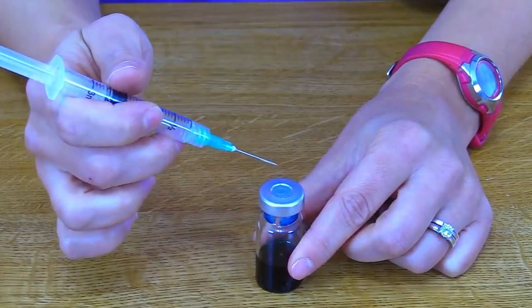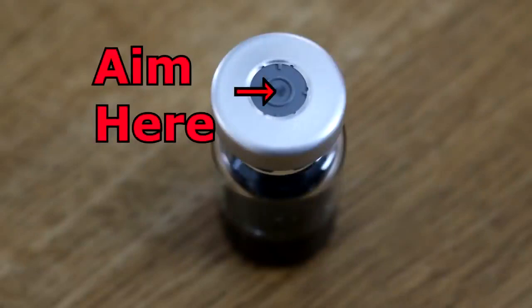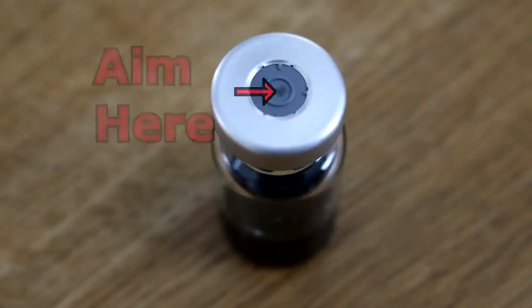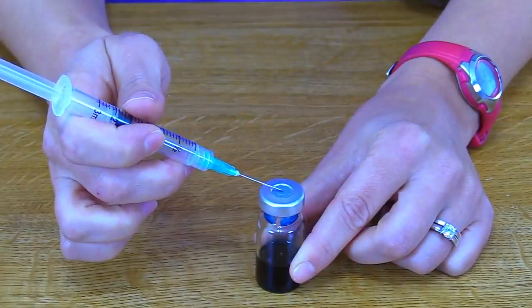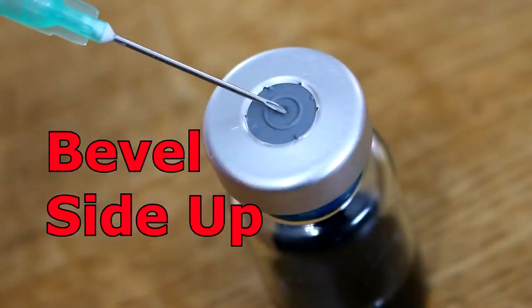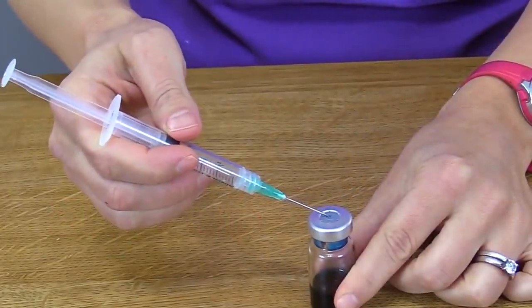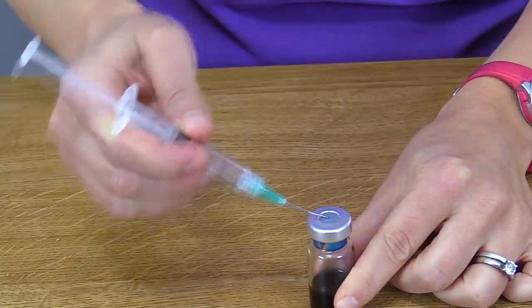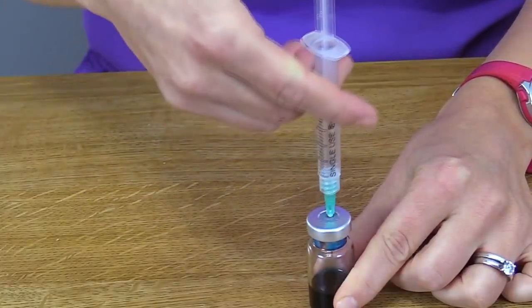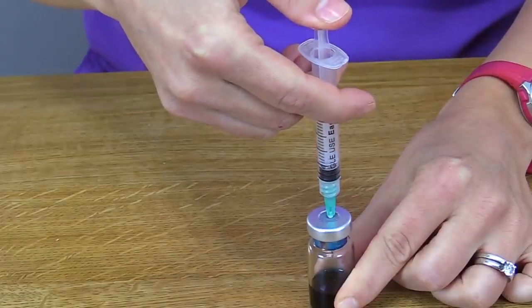Now look at your vial. Most vial stoppers have this bullseye type design, and we want to go in the center of the bullseye. So to do that, I'm going to position the needle at the center of the bullseye at a 45-degree angle with the bevel of the needle up, so it's facing me. And I'm going to apply pressure to the tip, and as the needle begins to penetrate the stopper, I'm going to push down while simultaneously rotating the needle to a 90-degree angle in one smooth motion. Then I'm going to inject the air into the air space of the vial.